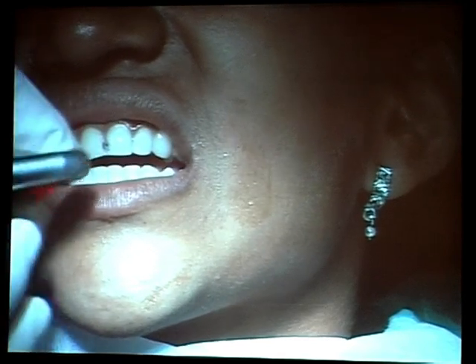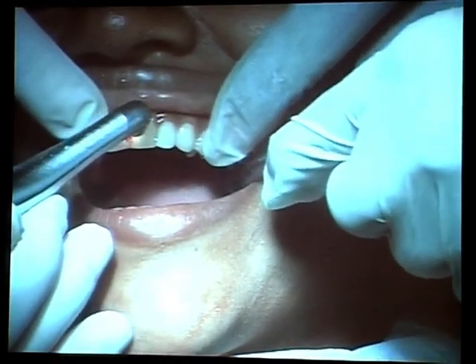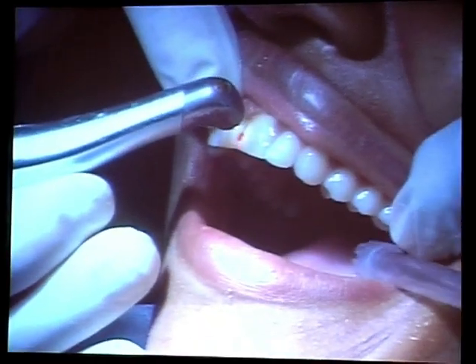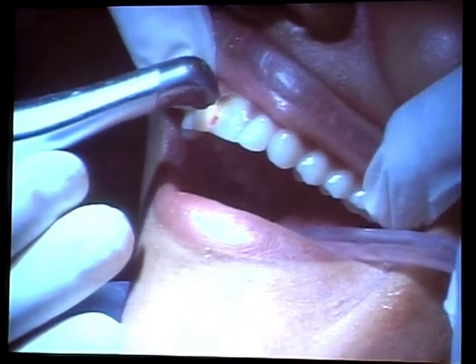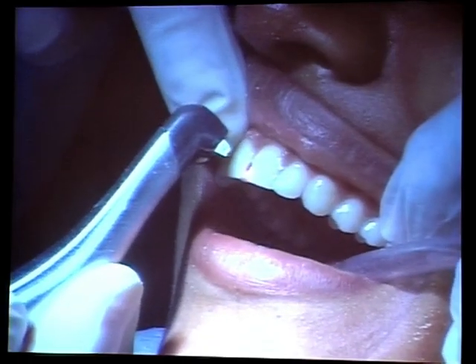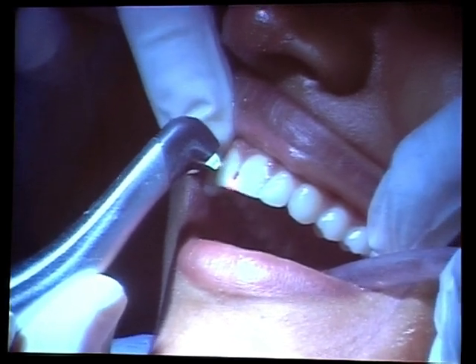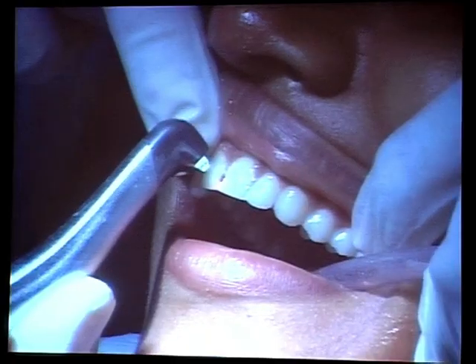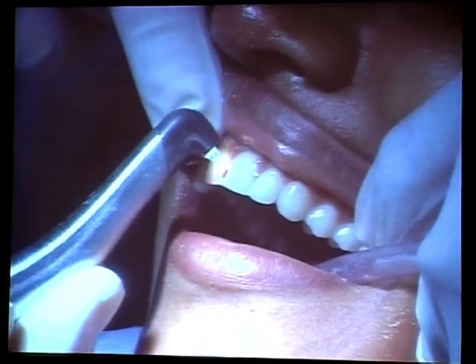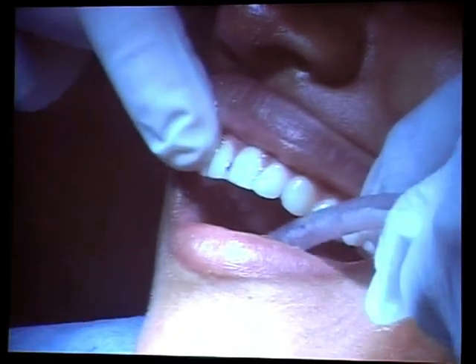And use the suction once again. You have an excavator or something like that?